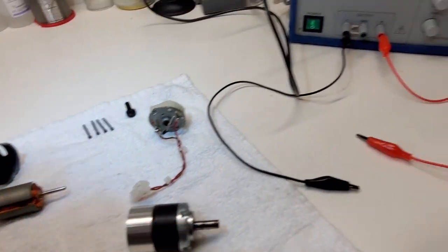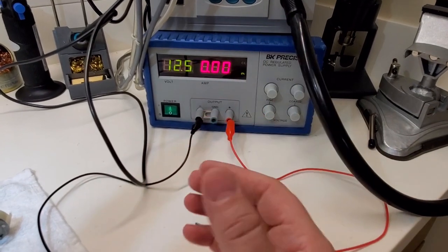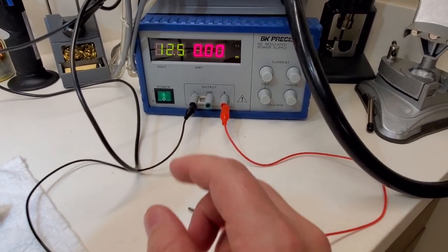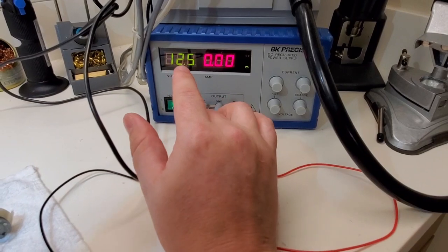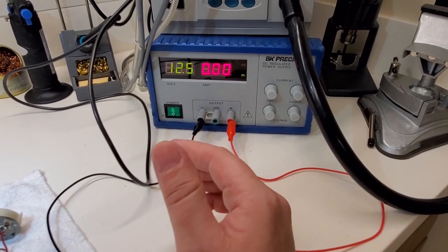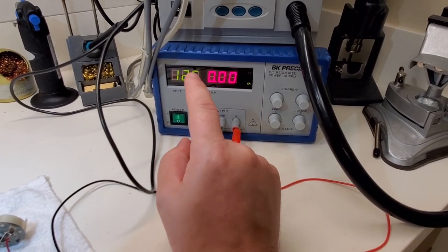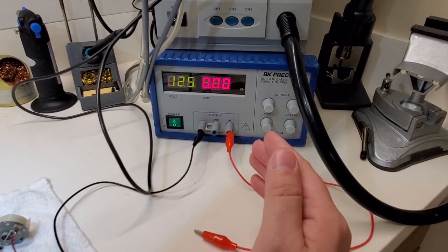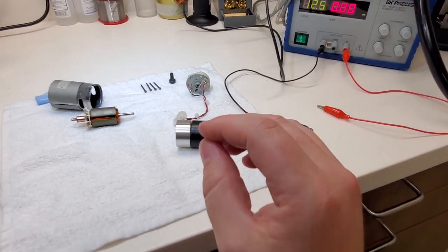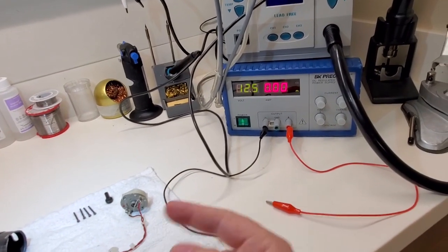So anyway, let's go back to the test. I hooked the motor up to this guy. I really wish I would have recorded it because it was very cool. In the data sheet, it says that it's a 12 to 24 volt motor. Obviously, that's how you're going to control your RPM. When I connect this motor up at 12.5 volts with less than an amp worth of current, it would not spin, which is unusual because normally it will spin just slowly.